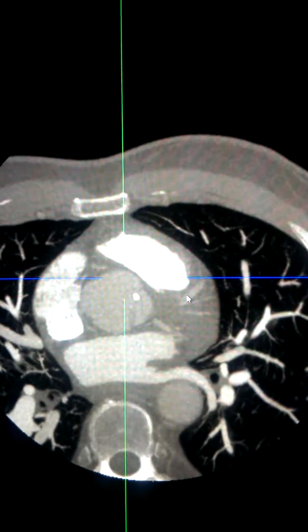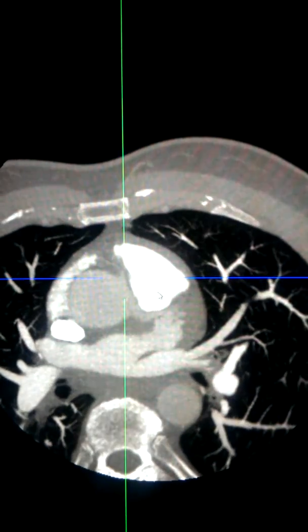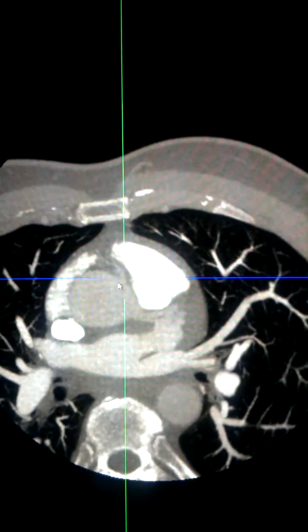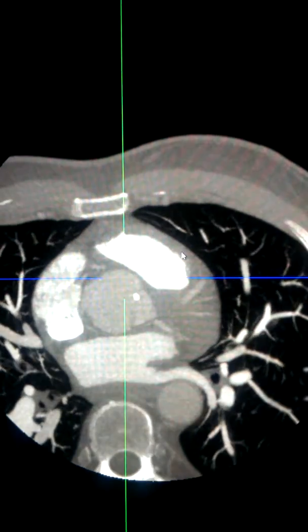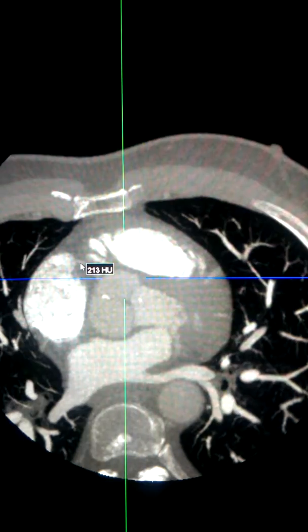We are now going to scroll through this vessel. Here is the origin of the right coronary artery, which then extends into the anterior aspect of the heart.